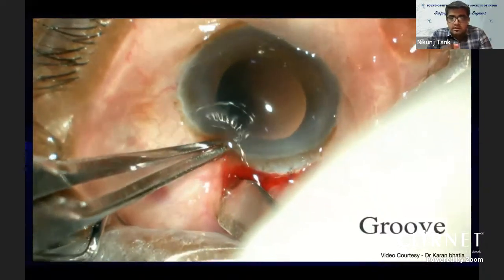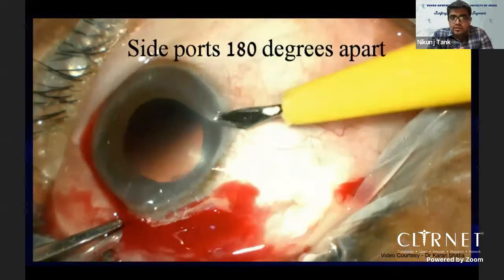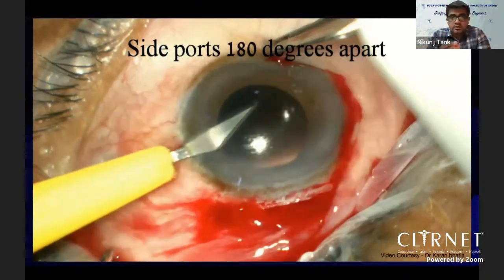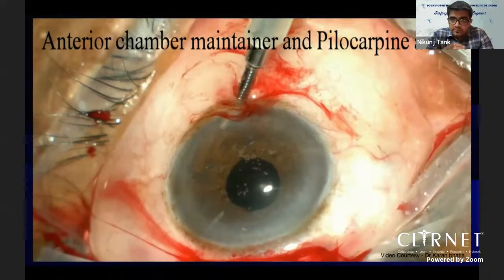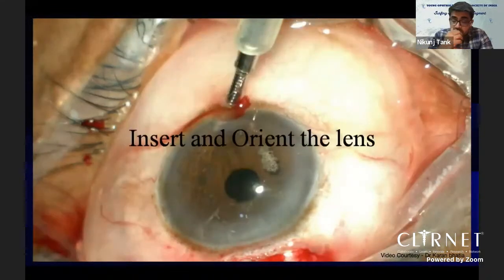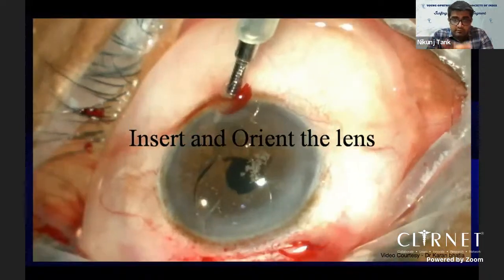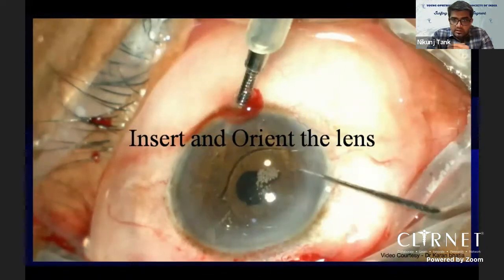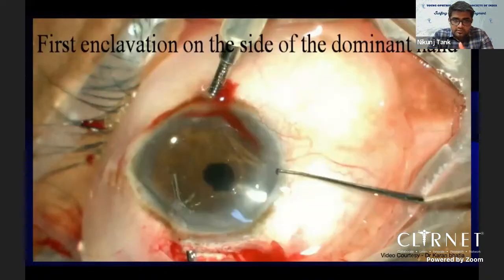You need a sclerocorneal tunnel, just like we make in SICS, and then two separate paracenteses, 180 degrees opposite on the temporal and nasal side. Here I'm using an AC maintainer to maintain the anterior chamber during the procedure, and Miochol is inserted to decrease the pupil size. We don't want very small pupil sizes in this case; a mid-dilated pupil is preferred.